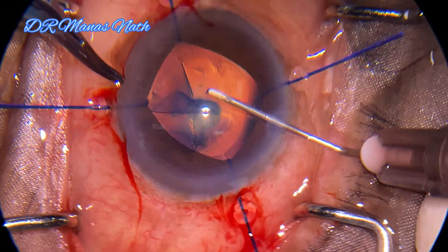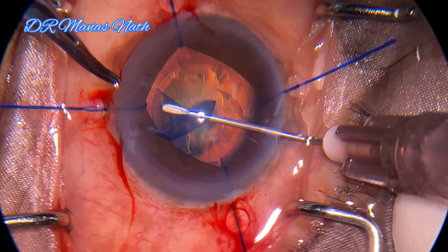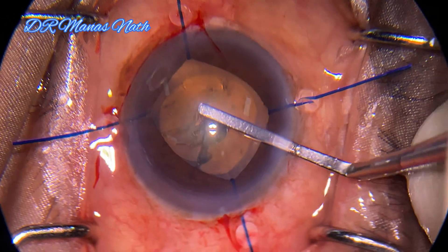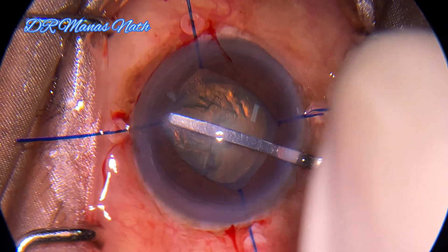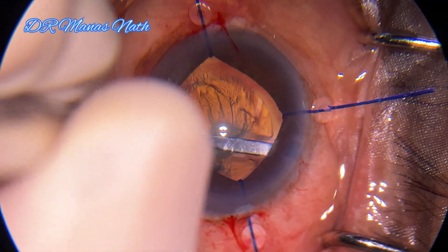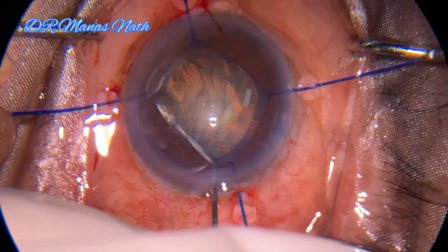Creating the capsulorrhexis here with the cystitome. As it's a posterior polar cataract, hydrodissection is contraindicated. I am using a spatula to do a spatula dissection, separating cortex from the capsule, and then doing hydrodelineation.